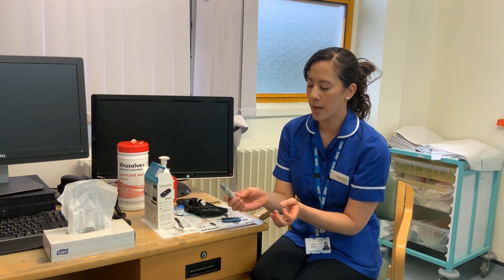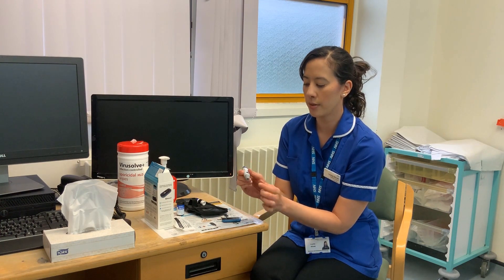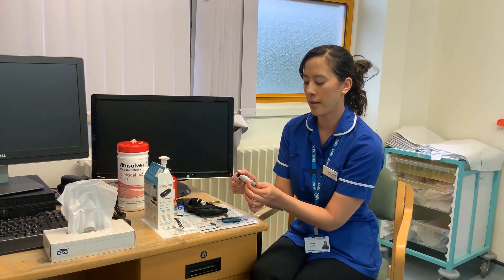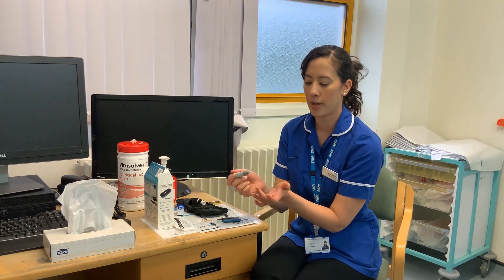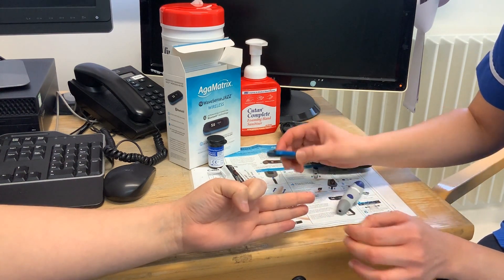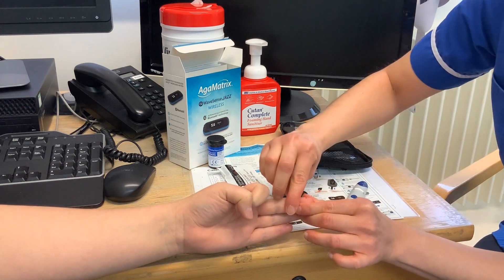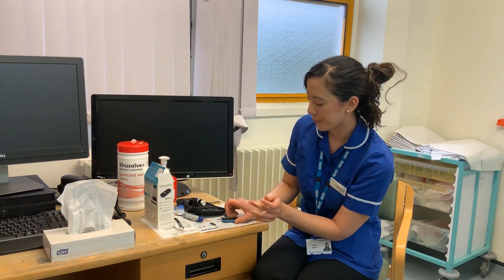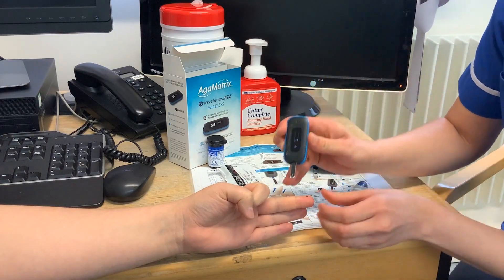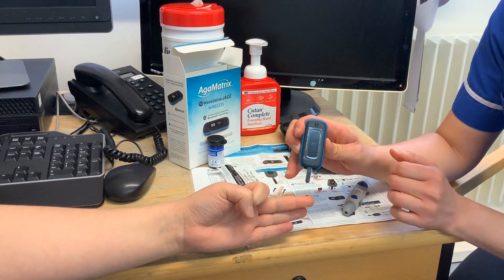Grab your lancet, put some pressure on your finger, and click the blue circle. If the blue circle isn't working, you need to reset it by pulling that bit out and then try again. Prick your finger — you want a nice blob of blood. You don't need too much, but you want a nice blob. Once you've got that, these strips are very sensitive, so at 90 degrees just gently touch it to the blood, and once you hear the beep, remove it.